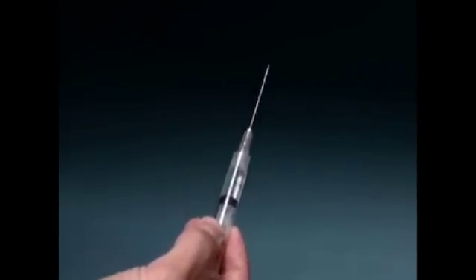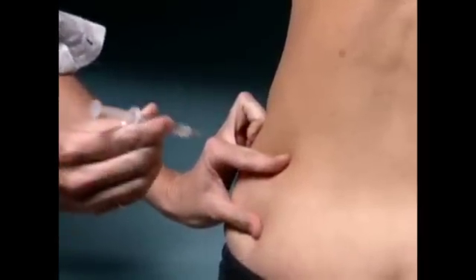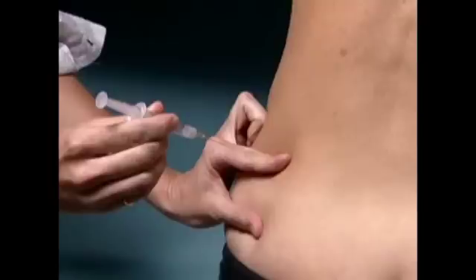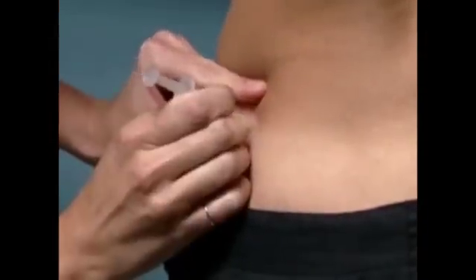Uncap the injection syringe. Hold the syringe the way you would hold a pencil. Use the thumb and index finger of your other hand to gently spread the skin at the injection site. Insert the entire length of the needle in a quick dart-like motion at a 90-degree angle, straight in.